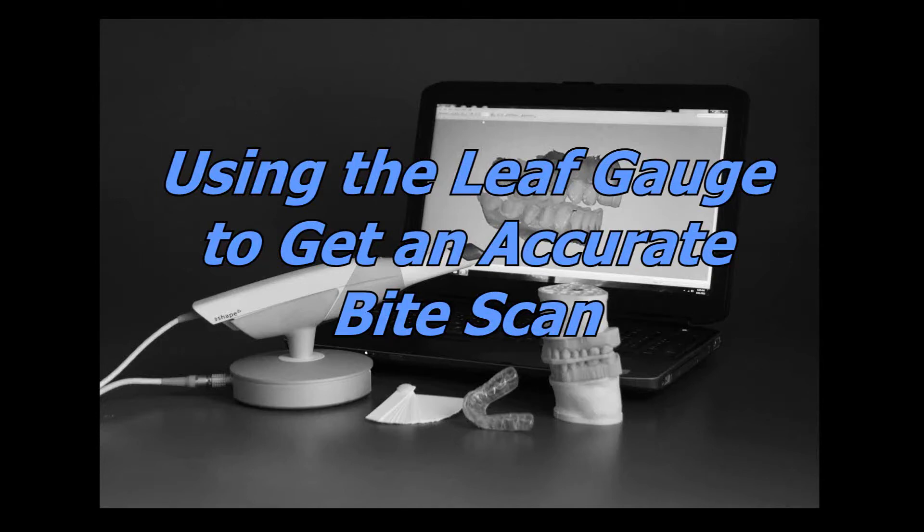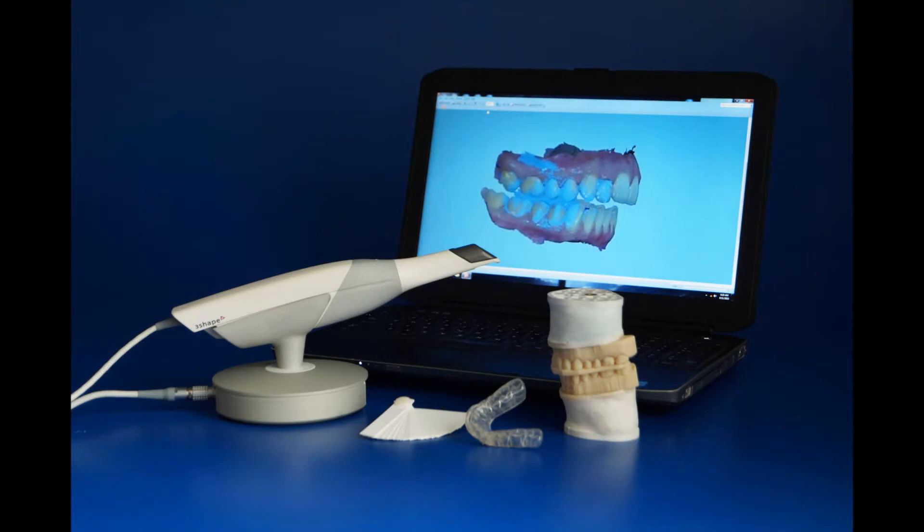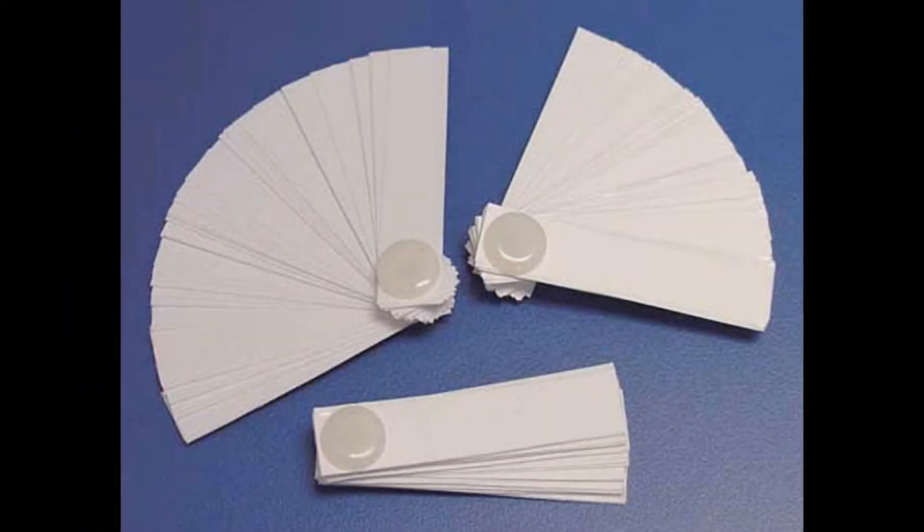Lengthy chair-side adjustments of the occlusion in splint therapy are often the result of the joint not properly seating at the time of bite registration. A proper digital bite scan position, along with your digital arch scans, will ensure that your splint experience with Great Lakes is as accurate and efficient as possible. Utilizing a quick and easy technique featuring the leaf gauge will assure that the joint is seated properly with the recommended vertical clearance, which will eliminate excessive chair-side adjustment when you are delivering the splint.